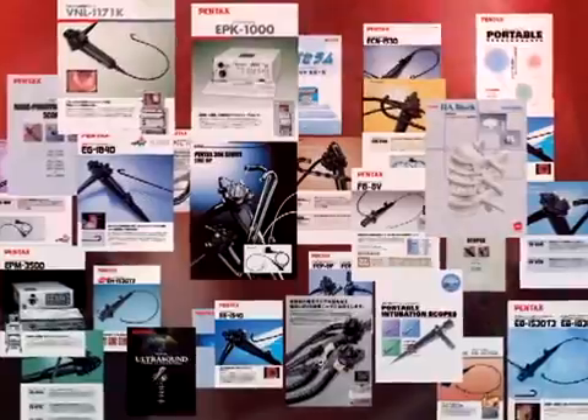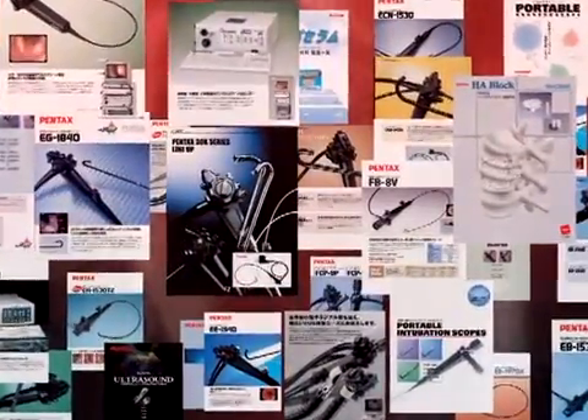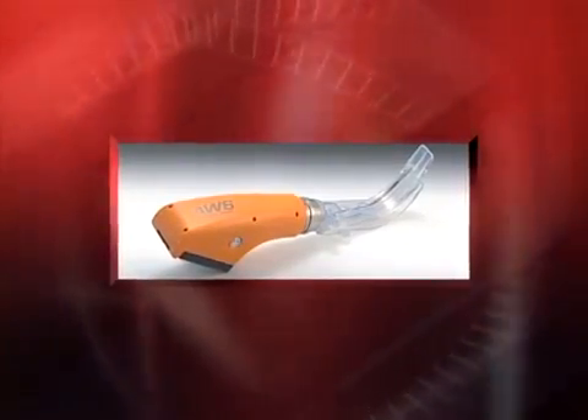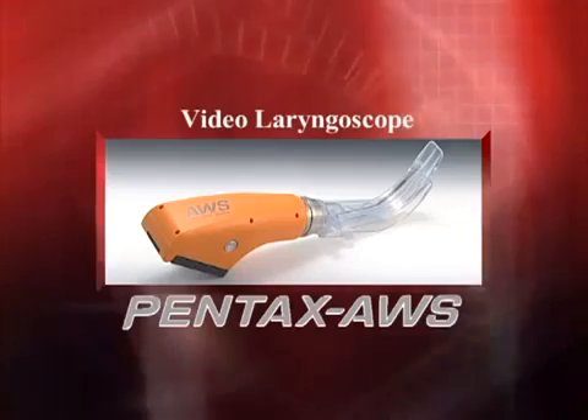Since its entry into the medical equipment market in 1977, Pentax has developed and manufactured a variety of endoscopes and other medical devices. Now, Pentax presents a video laryngoscope, the Pentax AWS.